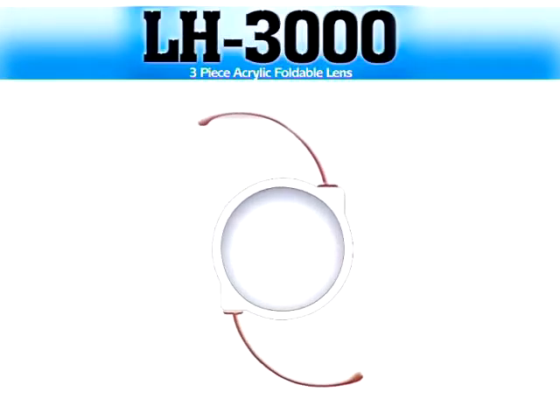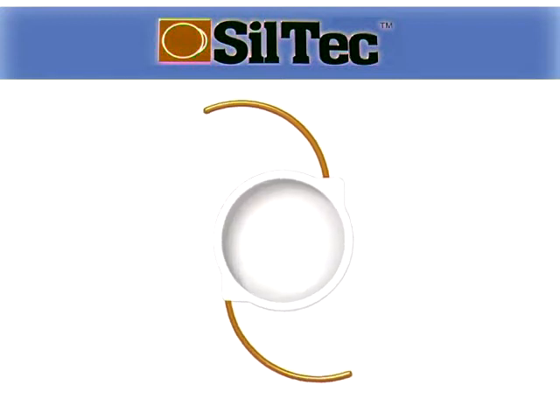The LH3000 is a three-piece hydrophilic IOL that can be injected through a 3mm incision using an inverted Y-tipped plunger injector. The Siltec is a three-piece silicon lens of a similar design to the LH3000, and so should be loaded with exactly the same procedure.